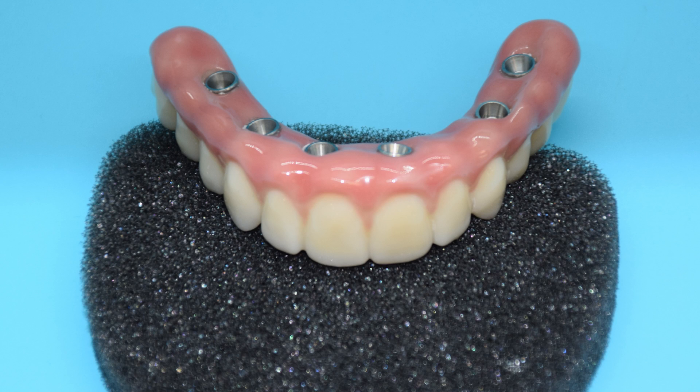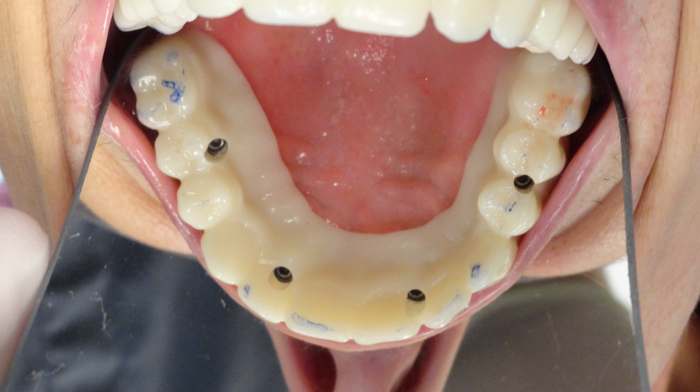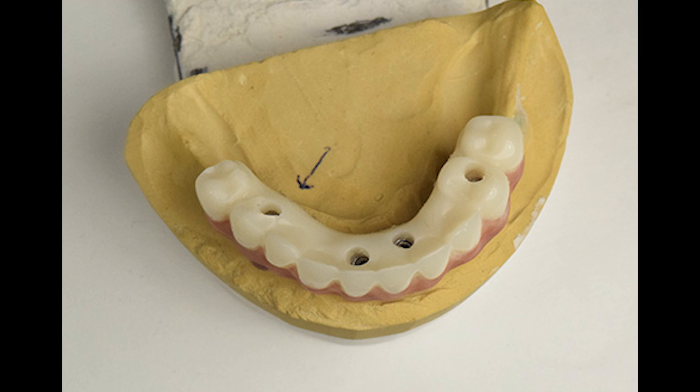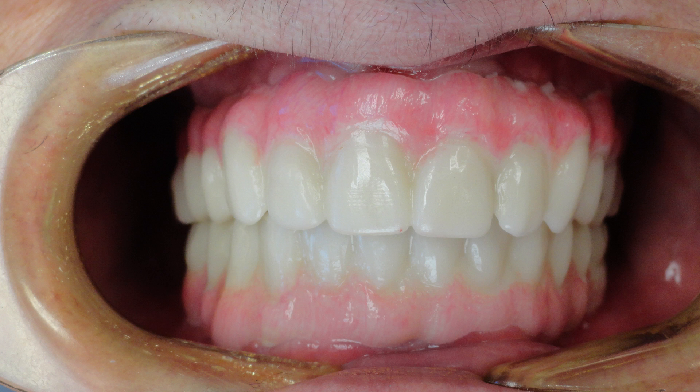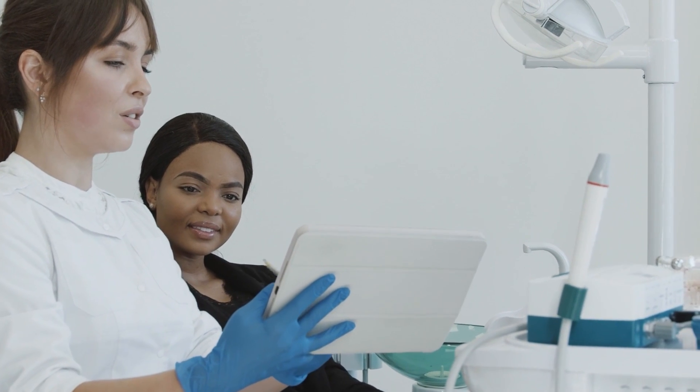The final step of a five-part process. Once the PMMA try-in has been seated and properly attached, final adjustments can be made. The PMMA try-in allows your dentist to better understand if any changes must be made for fit and phonetics. After a short trial period, the denture is returned with notes for adjustments.